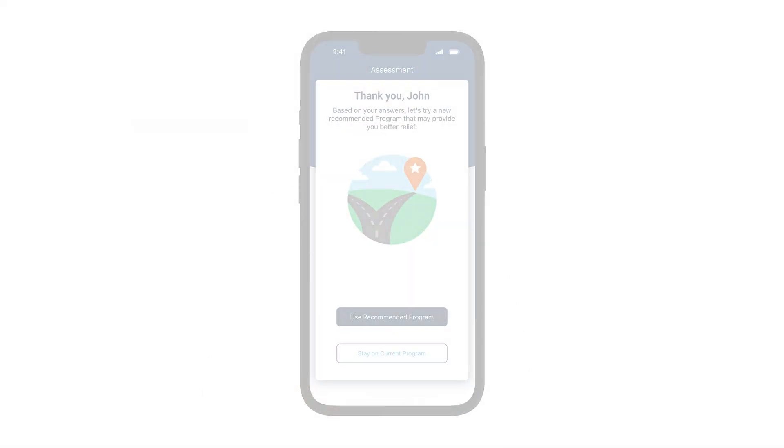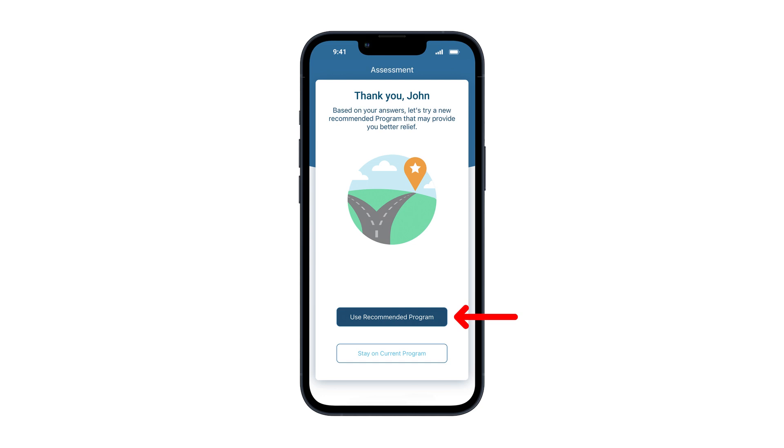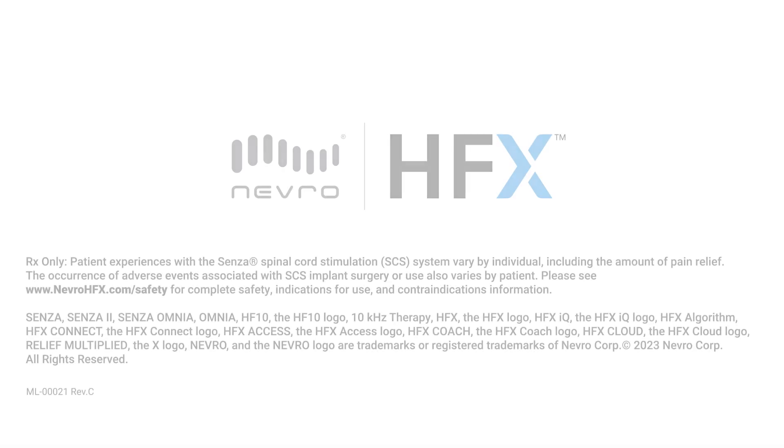When in IQ Mode, you may receive a recommendation to try a new setting. You can tap Use Recommended Program to accept the recommendation and your home screen will reflect the new setting.